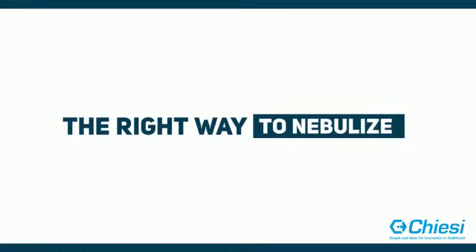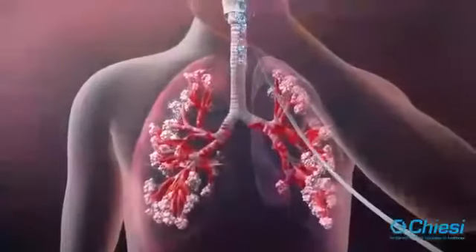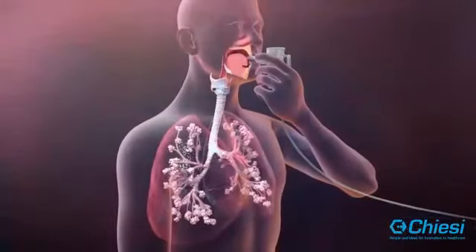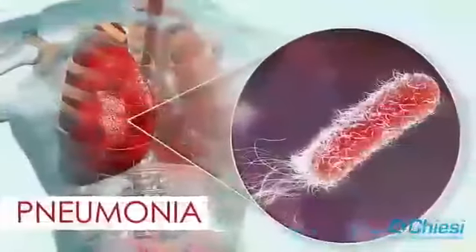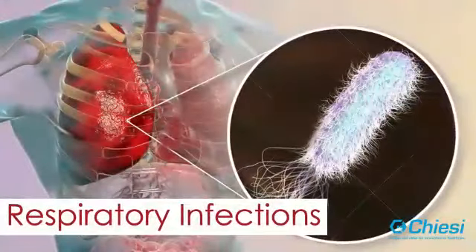In this video, we will learn the right way to nebulize. A nebulizer is a drug delivery device used to administer medication in the form of a mist to be inhaled into the lungs. Nebulizers are commonly used for the treatment of asthma, COPD, pneumonia, cystic fibrosis, and respiratory infections.